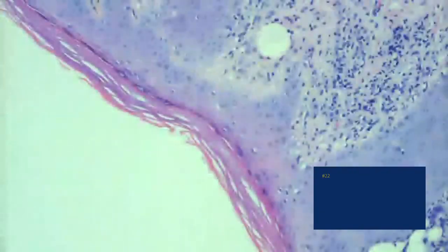So sometimes at grand rounds, the professor asks you to get the differential diagnosis of this. Just like with lupus profundus, you can say you could think of the other 5 or 6 lymphocytic infiltrates, but in this case, because it has all the ancillary features, you really wouldn't think about any of them. So this would be discoid LE, and you wouldn't even want to get a differential diagnosis.